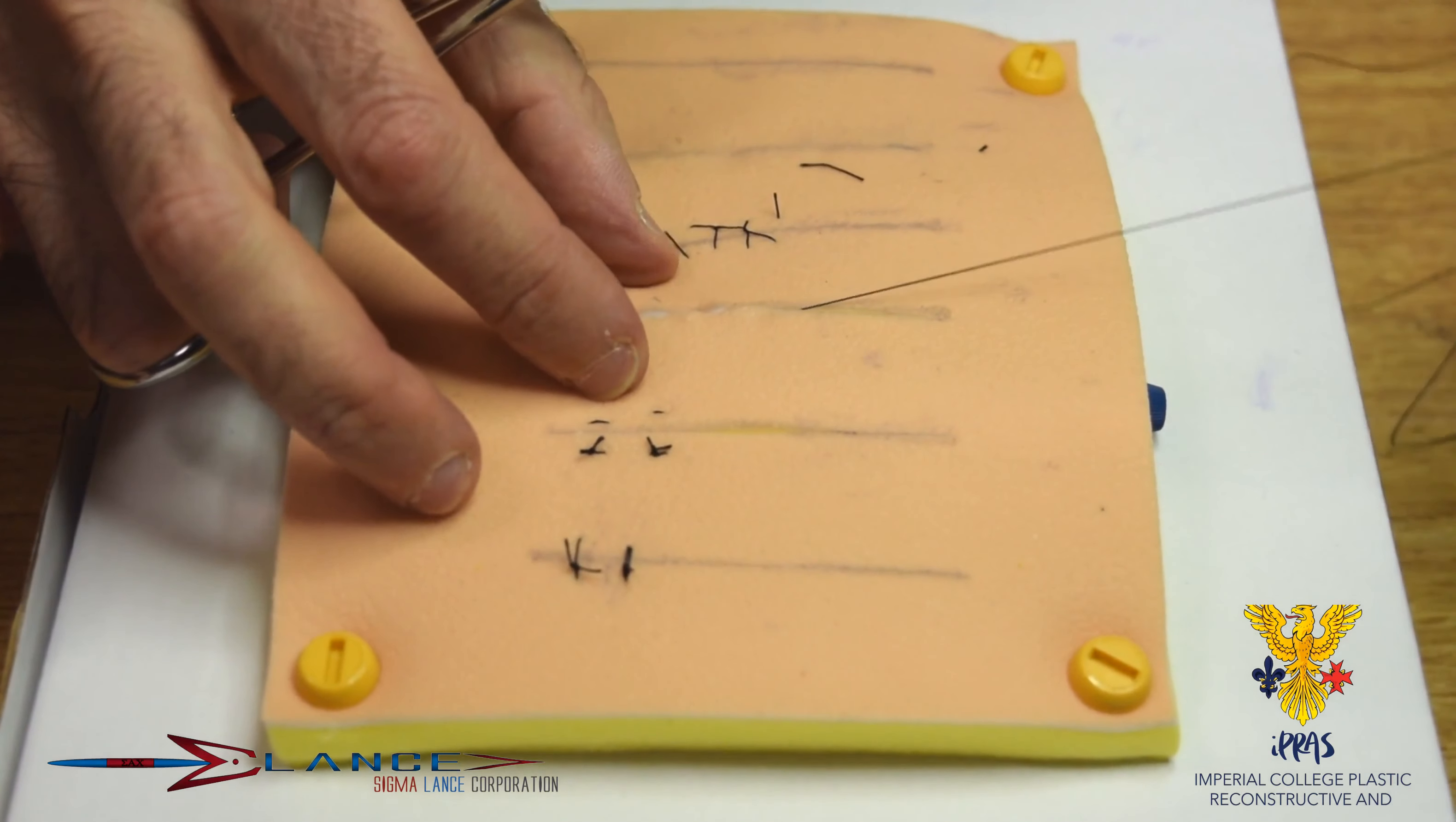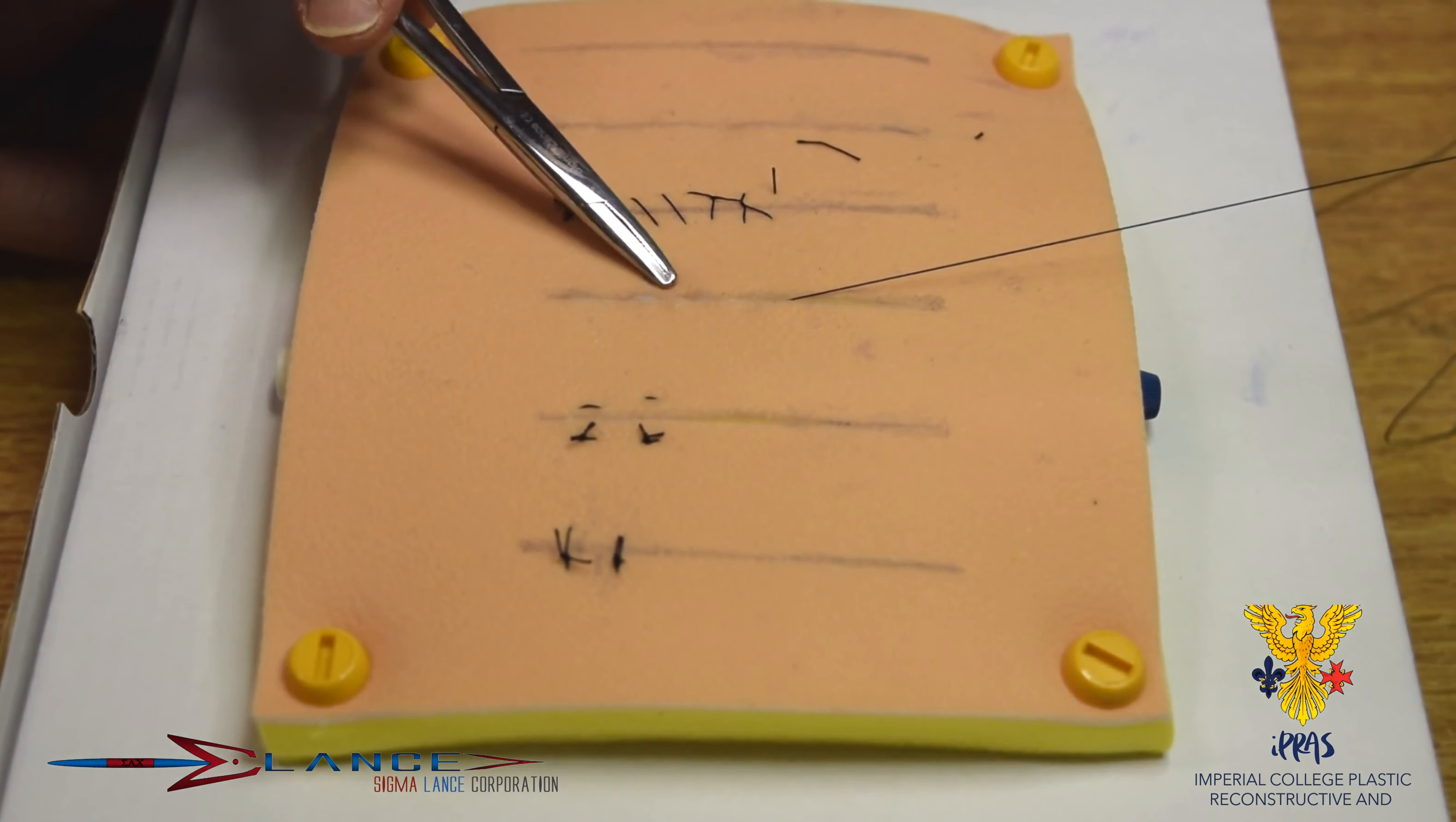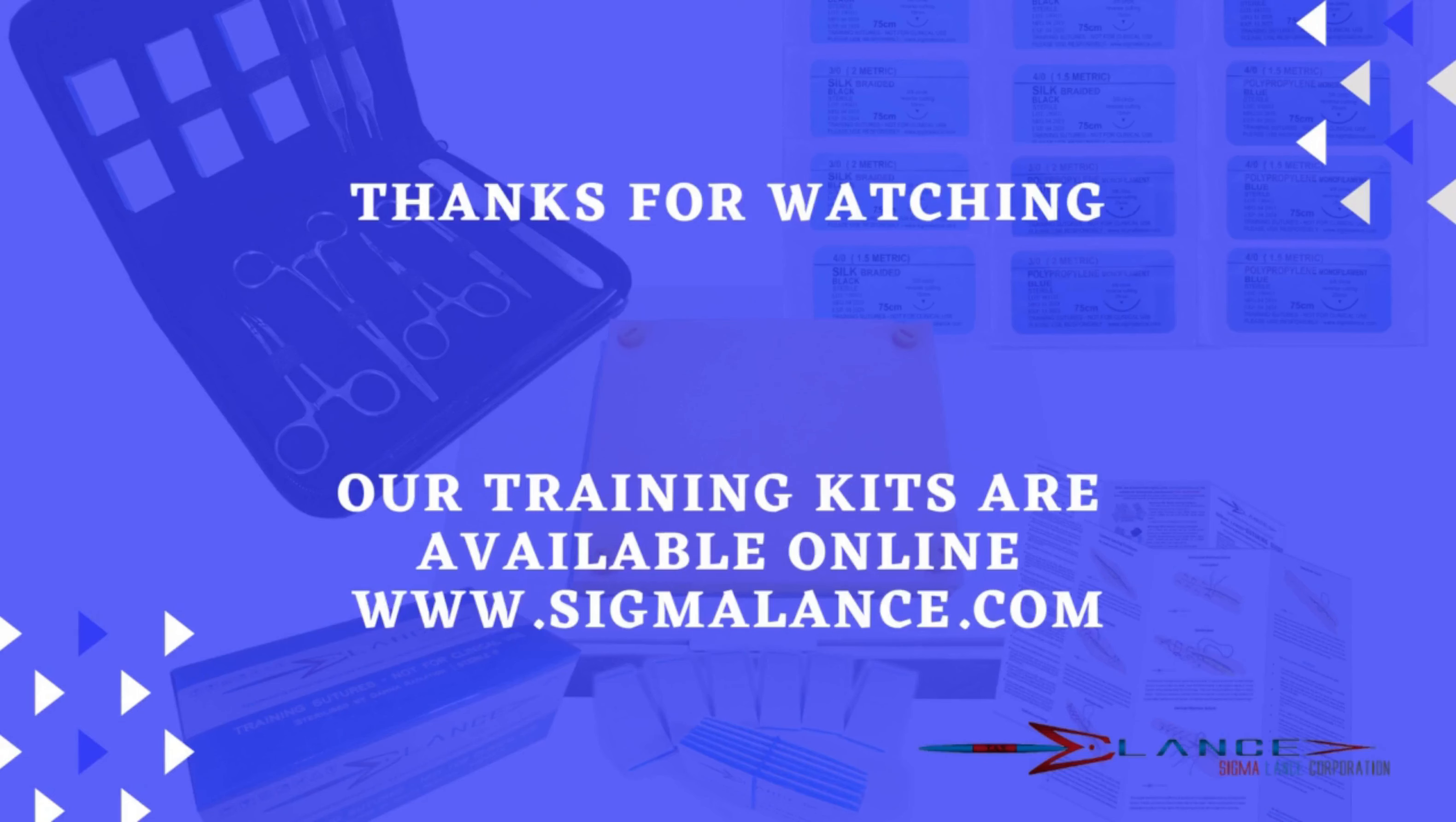And that's exactly how it should be in real life, where there's no gaps between the skin. This is a good primary closure because there's literally no gapping. And the closure will then continue, and we'll close it off as I demonstrated in the last one, with an Aberdeen knot at the end.